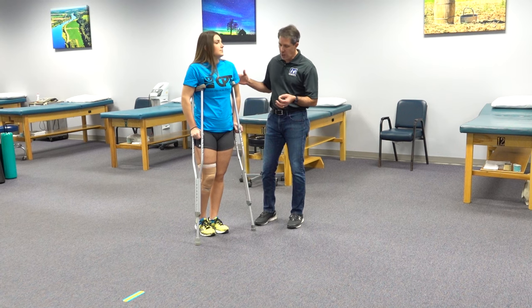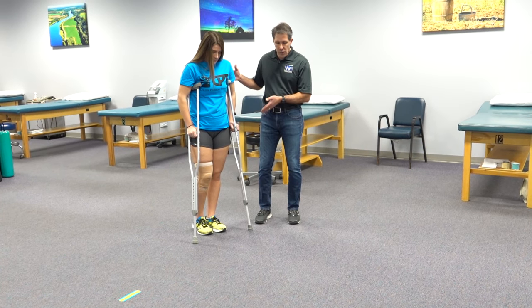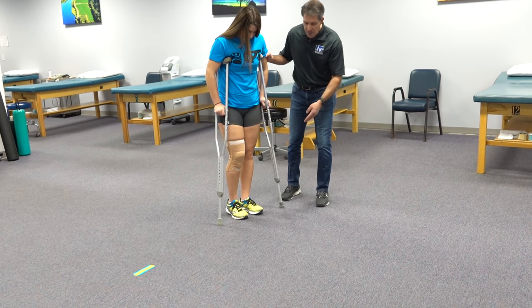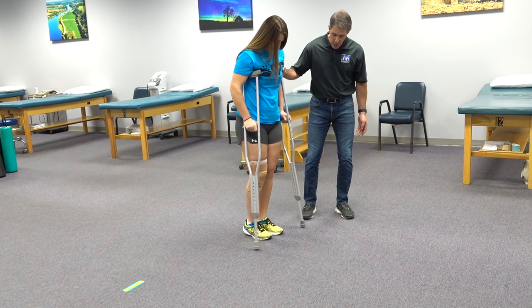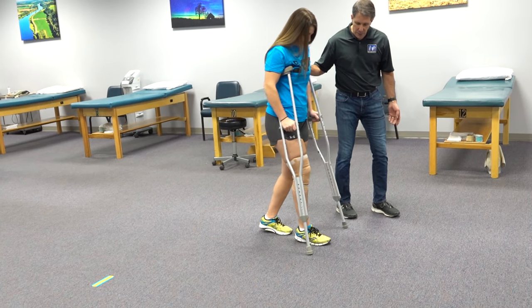So we're going to start with what we call a step-two gait, where we just move the crutches ahead with the affected leg and then we step through with the unaffected leg. We're putting pressure through the arms and the affected leg is following the crutches.